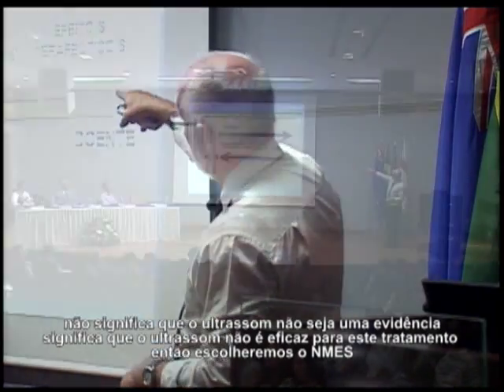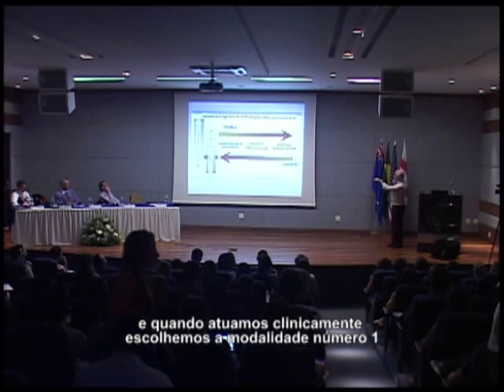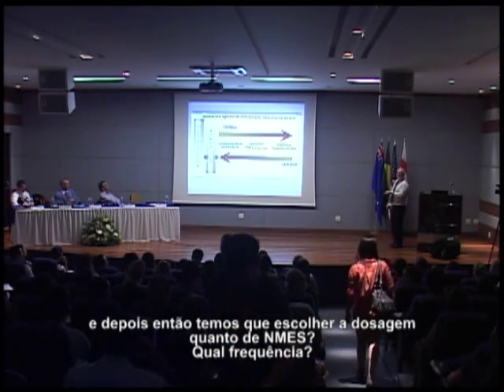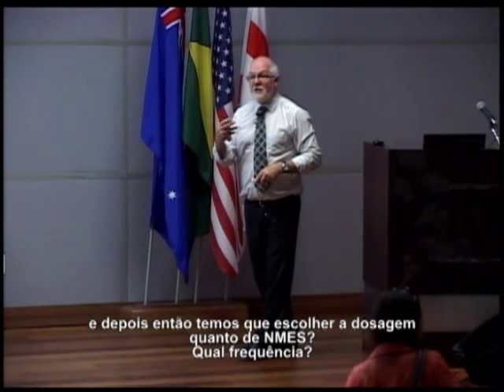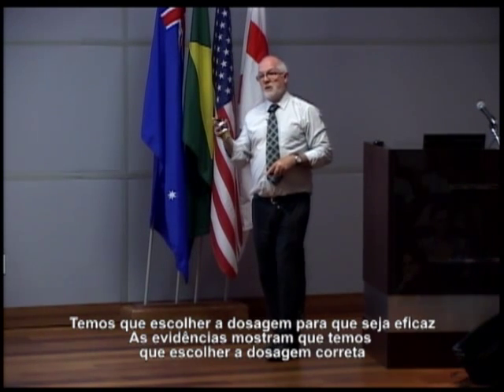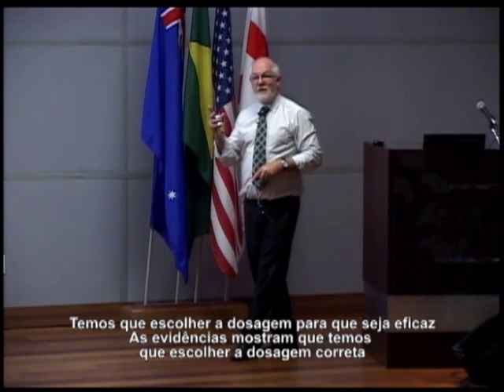All right? So we'll choose NMES, and when we work clinically, we choose the modality, number one choice, and then we have to choose the dose. How much NMES? What frequency? What setting? What pulse? What machine? We've got to choose the dose in order to be effective. The evidence says we must get the dose right.